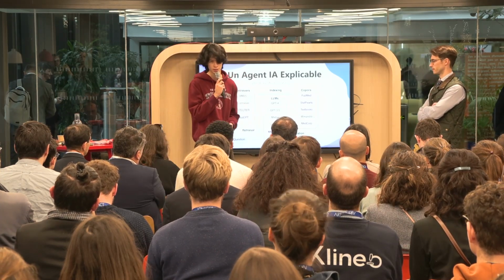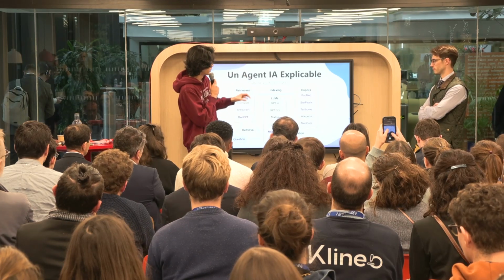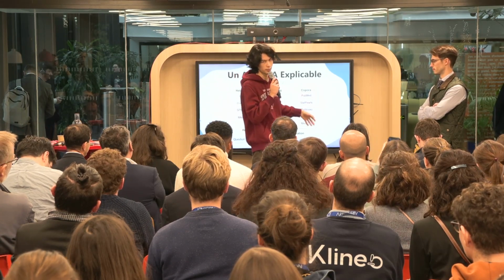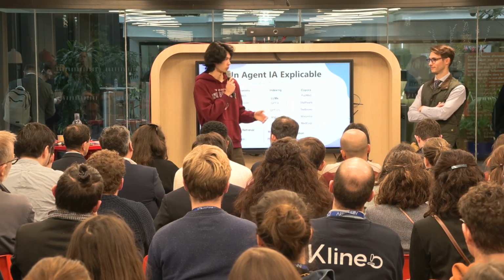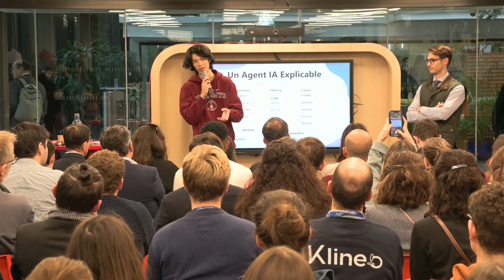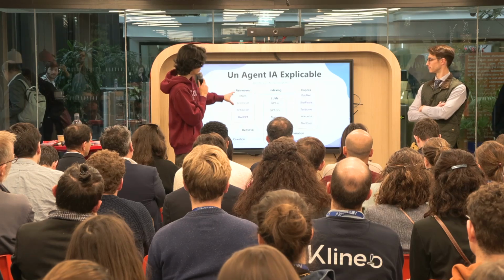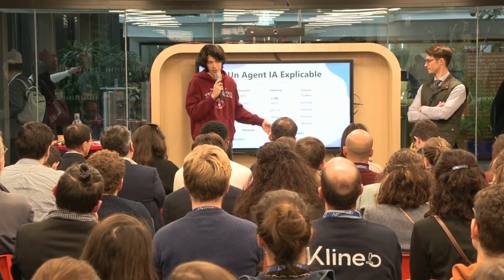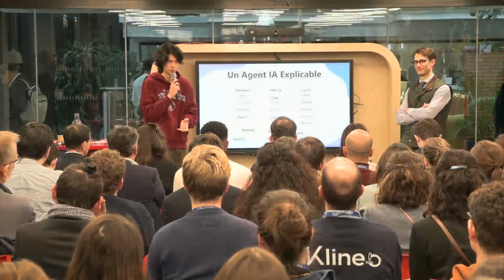We're agnostic to which language model we use. And what we have is data, which is, for example, downloading the entirety of Wikipedia, PubMed, and now we're striking deals with hospitals about getting also the corpus of their anonymized reports and patient histories. And then a retriever, which can look for specific queries inside this corpus, like, for example, Google search, right? And it's actually quite an interesting but difficult field of research.